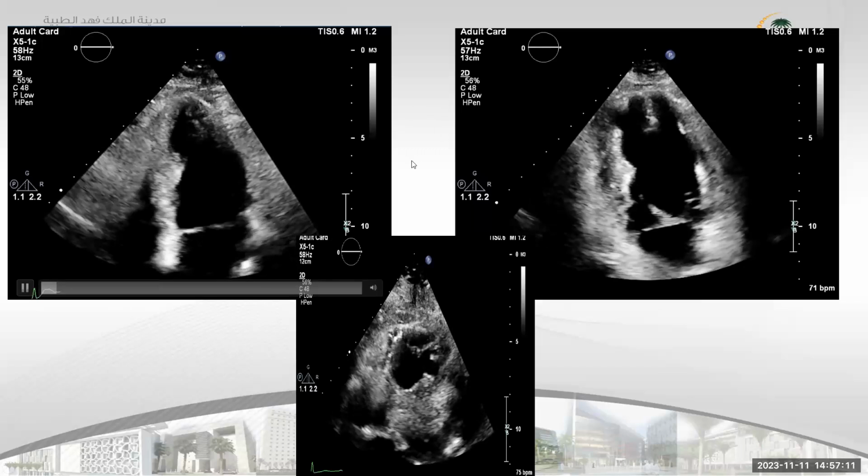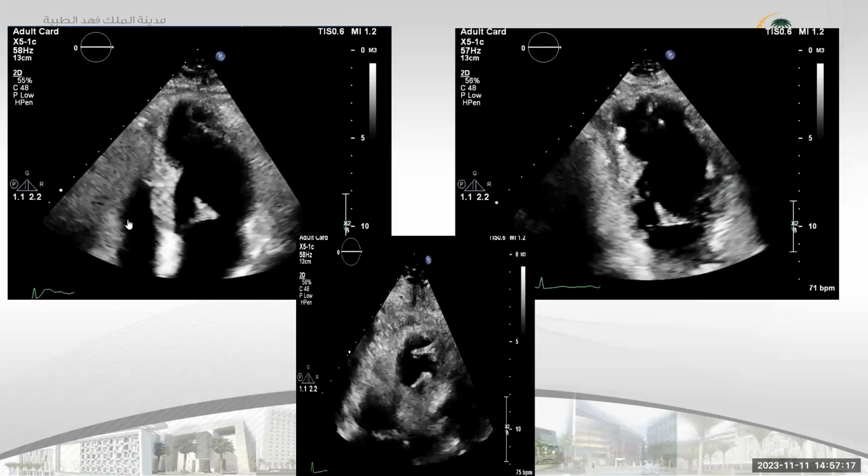By the way, I remember now, one of the previous questions was the pulmonary stenosis. There was no PDA. Somebody wrote PDA. There was a very, very small shunt, not important.